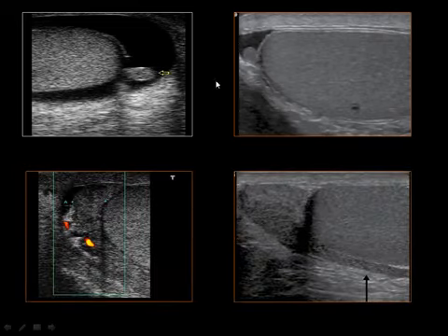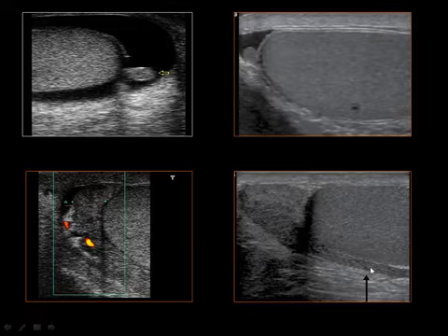This is the epididymis, isoechoic with the testis, and its echotexture might be coarser. The head normally measures 10 to 12 mm in diameter and lies lateral to the superior pole of the testis. The body extends inferiorly from the head and is found posterolateral to the testis. The normal body measures less than 4 mm in diameter. The body is hypoechoic and often is defined only by its anterior and posterior walls. The tail and the appendix epididymis are not routinely seen unless there is hydrocele.